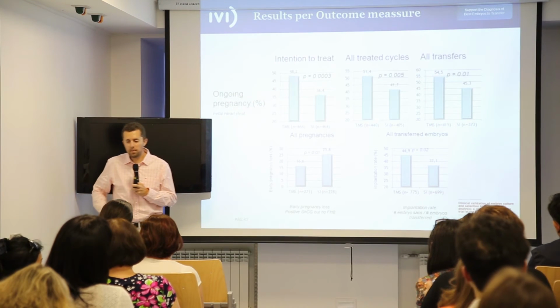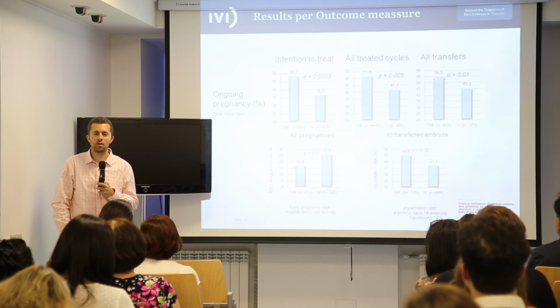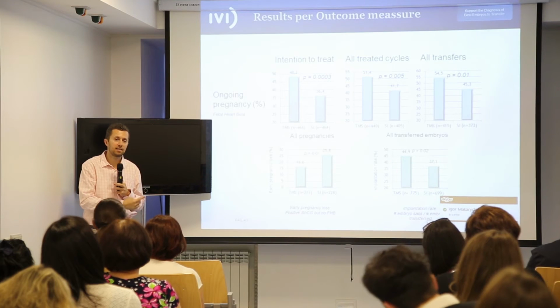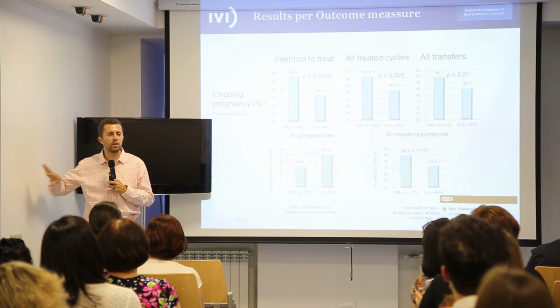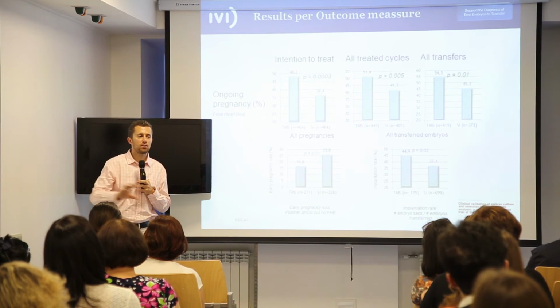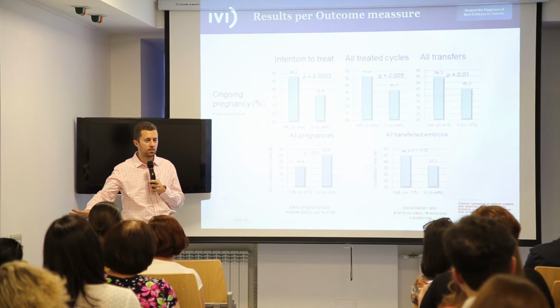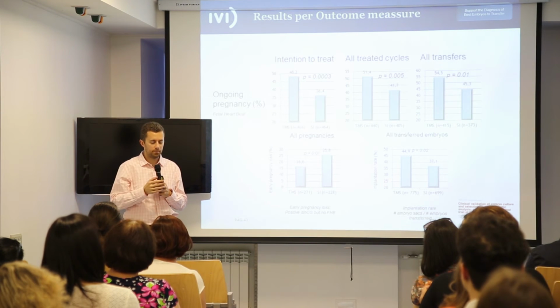The other one is the one that we published in Fertility and Sterility, and in that study, there was an improvement in the outcome of around 10% in the implantation rate and the clinical pregnancy rate, and a decrease in the miscarriage rate of around 10-12%. But the difference in the study that we published is that we compared a standard box incubator with the embryoscope. So the main criticism of our work is that the improvement may be a combination of all things: first of all, better culture conditions, and second, the morphokinetic selection. In the study of Goodman at Cleveland Clinic, they were comparing the same technology.